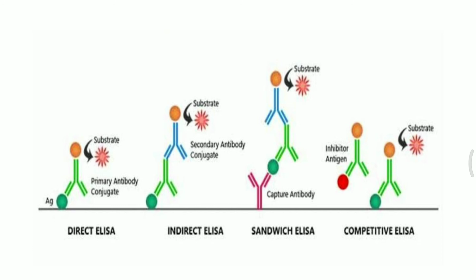Now all the antigen and primary antibody will react with the secondary antibody and form a structure which is a conjugate structure containing the antigen, primary antibody, secondary antibody along with the enzyme. And as soon as the substrate is added, again there will be color change which can be seen.